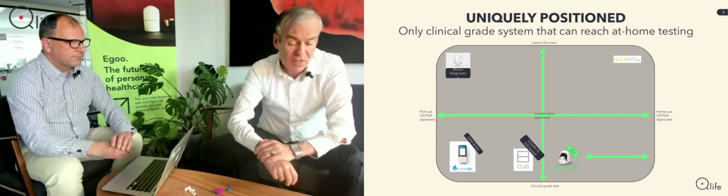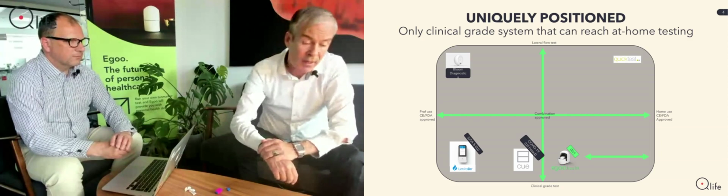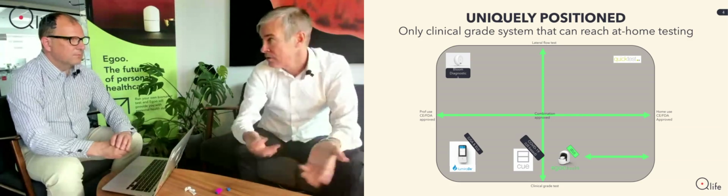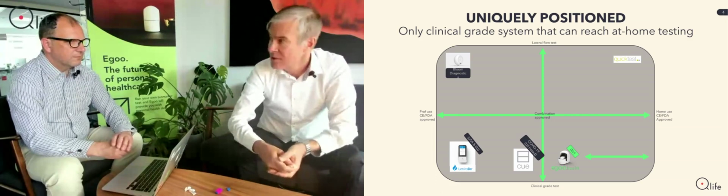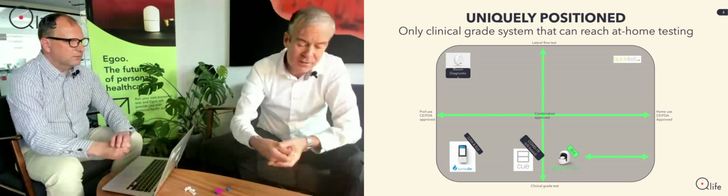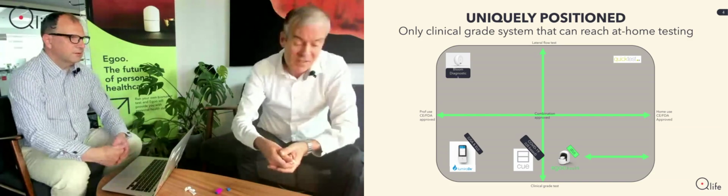We measured their CRP level over 6 to 8 weeks. The interesting thing we saw was that once these Ironmen had performed the Ironman, they had very high CRP levels, up to around 30, 35. Wow. Which means that after such a tough race, they were clinically ill, which is interesting.